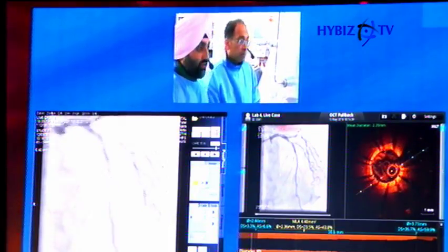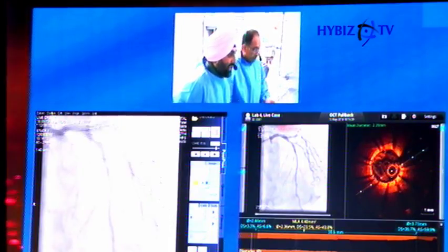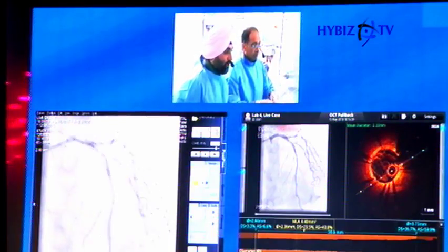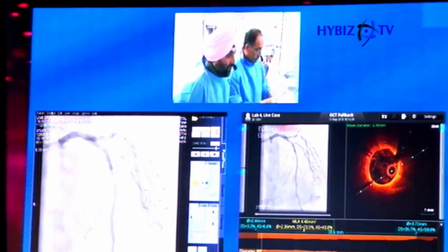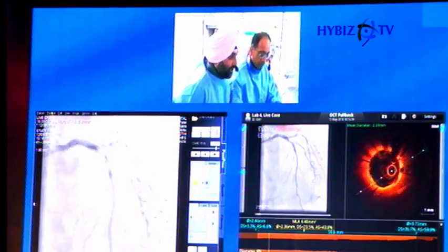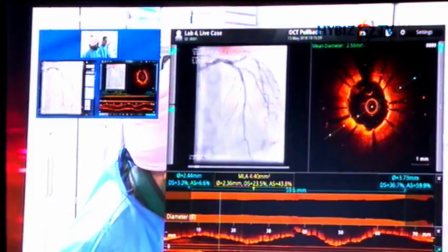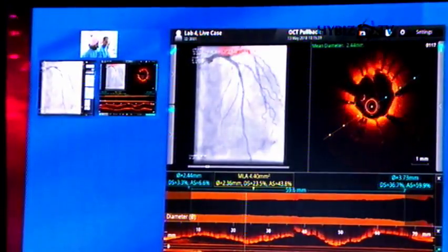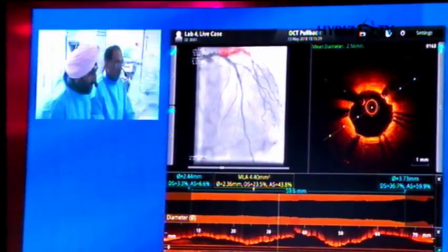Just because this is a live case, the co-registration did fail there, but we can still follow the lens marker. So we're just getting into the distal stent there. We're just going to do it by eye, but then we can use some of the newer software on the OCT catheters to see exactly what's going on. At the moment, we're just looking at apposition, and we'll put the apposition software on in a second. Everything looks to be apposed there, but we're going to assess that properly with the software. And then we're going to have a look at stent expansion as well.